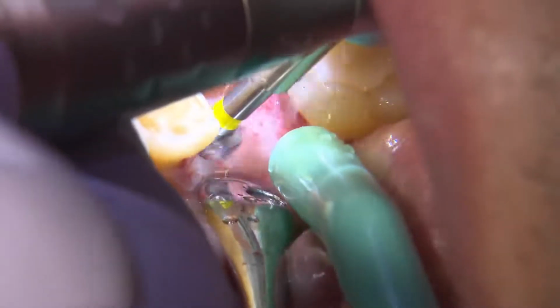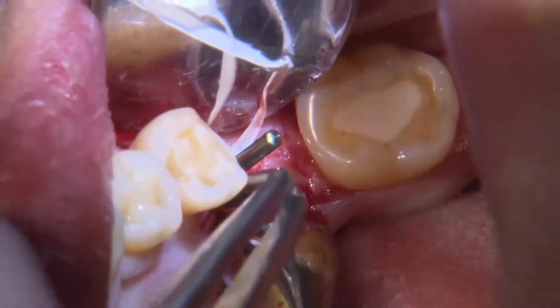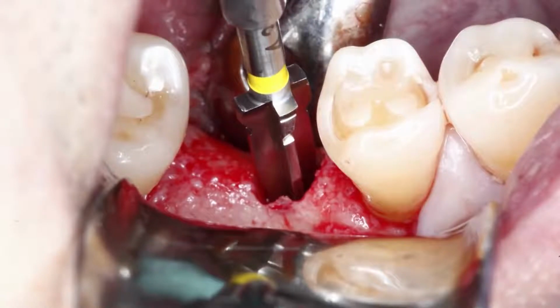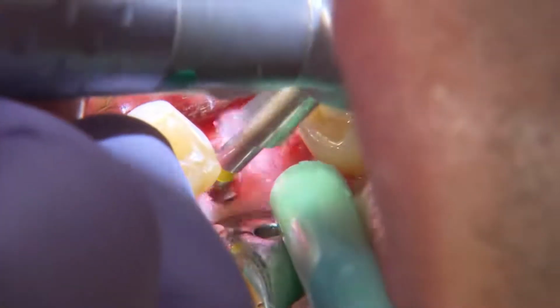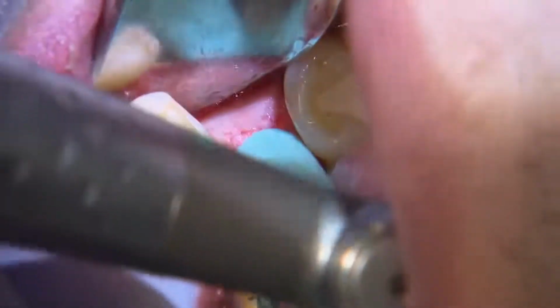Now what I do is, as I move up in size with the shaping drills, I want to use my parallel pin again to make sure that I'm going in the right direction. As you can see here, I'm not. So now I have a chance with the next shaping drill to upright the area and make sure that I can place the implant in the proper position. So now I can lean my shaping drill to the direction where I want to create that osteotomy. And this technique gives me a chance to place the implant in the proper position.